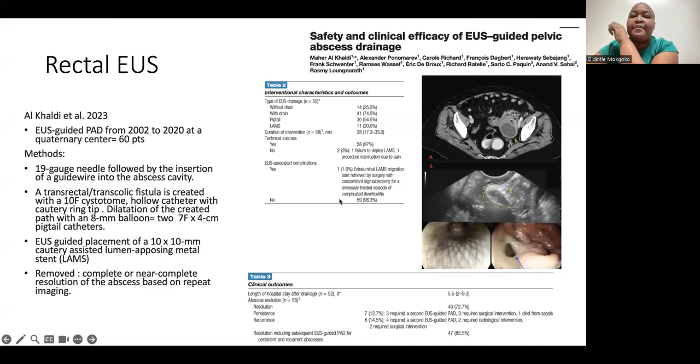They had very few patients that actually had any endoscopic ultrasound associated complications. Again, that was because of extraluminal stent deployment, where the surgeons then had to go in and fish out the stent and fix the perforation that had happened as well. So relatively safe, relatively successful procedures.